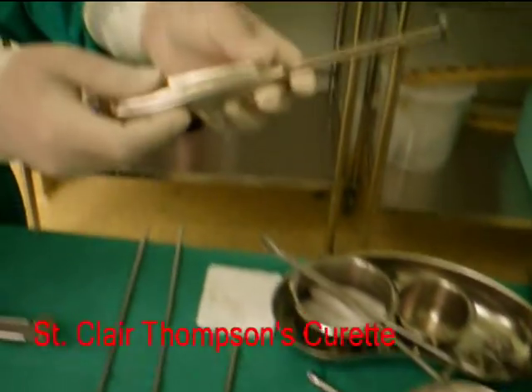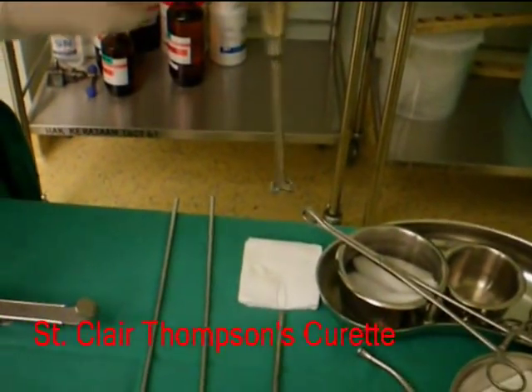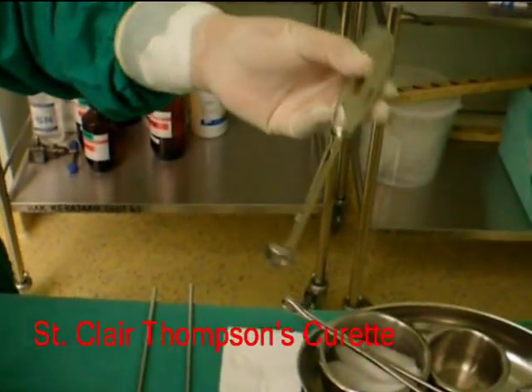In case there is a need to remove the adenoid glands, a St. Claire Thompson's curette is used.